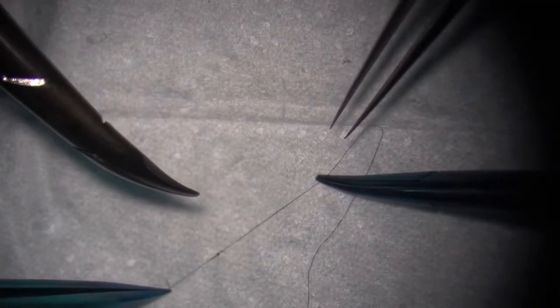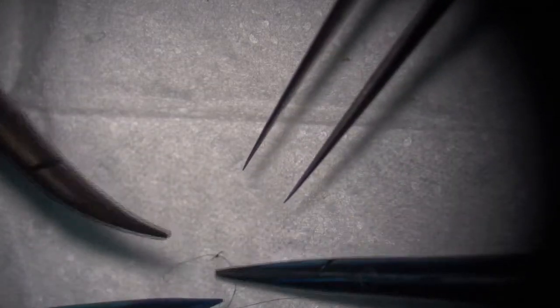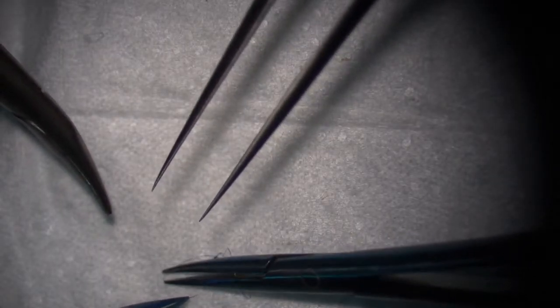Just get my knot down. So my knot is down. Bring this over. And then I'd be putting. Yeah. So now you see the same thing. Holding the suture in front and above of the forceps. Okay. And then get close in between. Get it down. Yeah. There we go.